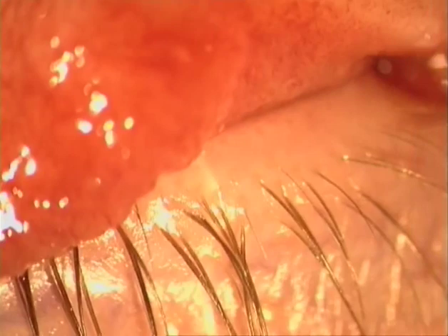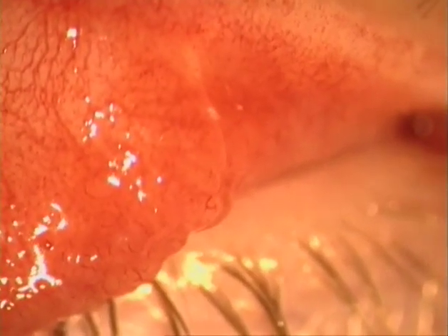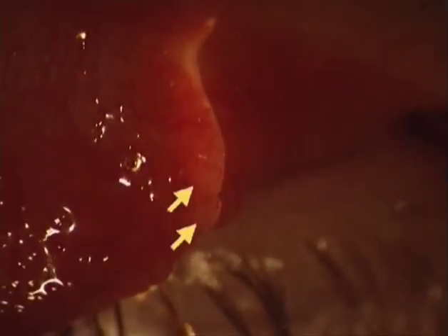In the upper lid, we find the fully grown follicles at the lateral ends of the tarsus where the conjunctiva covers orbital tissue. Again with the homogeneous central mass and the surrounding vascular corona.